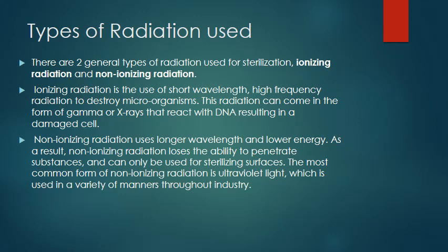Non-ionizing radiation uses longer wavelength and lower energy. As a result, non-ionizing radiation loses the ability to penetrate substances and can only be used for sterilizing surfaces. The most common form of non-ionizing radiation is ultraviolet light, which has been used in a variety of manners throughout history.